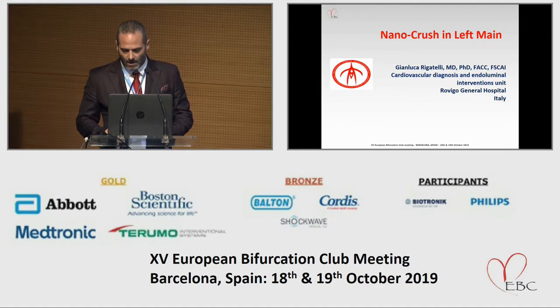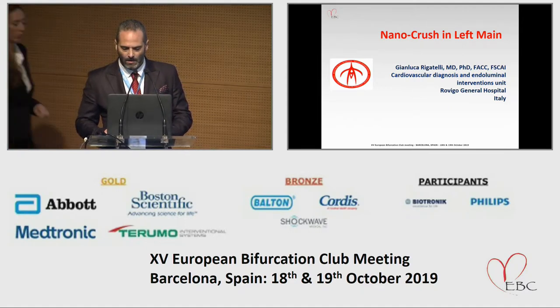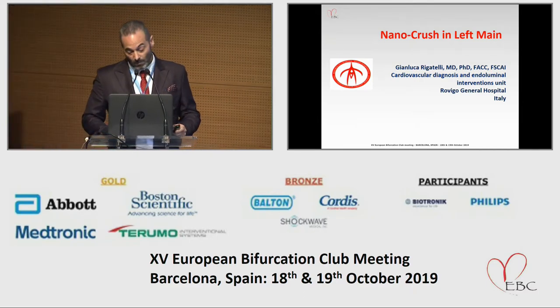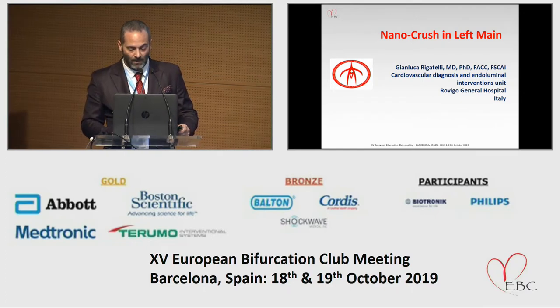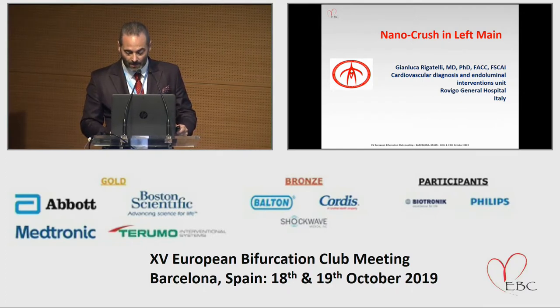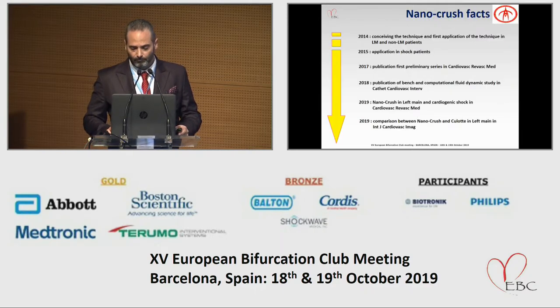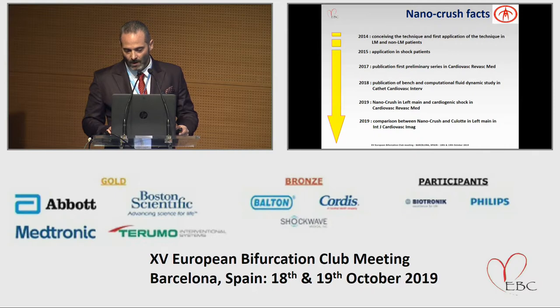We came up with this idea in 2014, and the aim was to crush very little, with balloon crush very little, and using only ultra thin strut stent technology. We applied it earlier in shock patients because it was very fast to do, and then we published a series of papers, and at the same time we performed some bench study and some flow dynamic study. The steps are very quick and very fast.